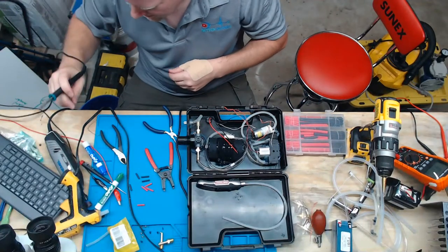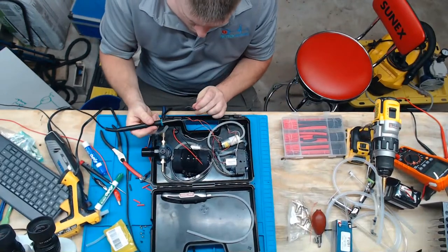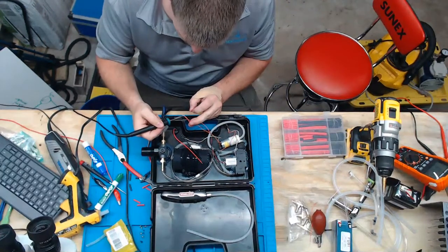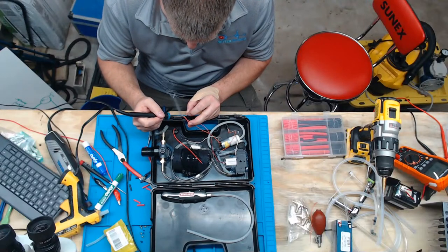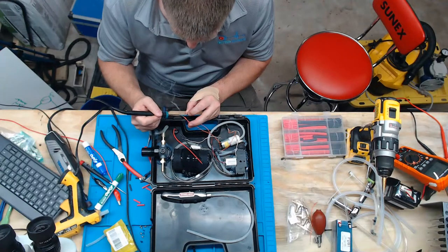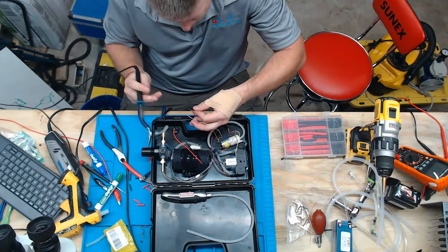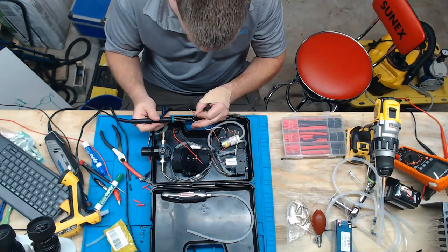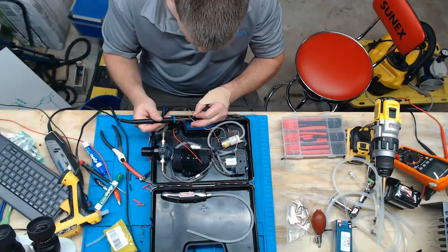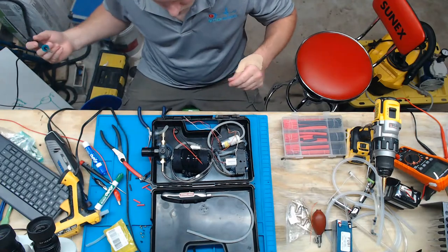Let's see. I got my good old soldering iron out. I'm going to tin up some wires. These ones right here are for the motors. All right. Cool.